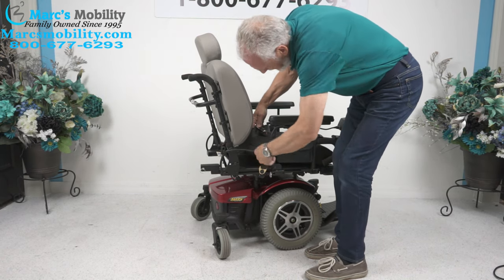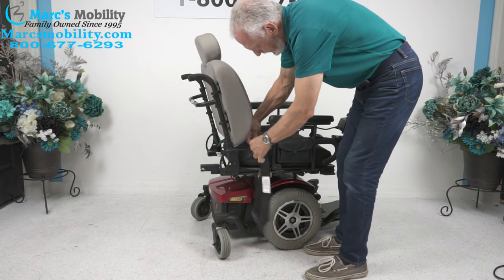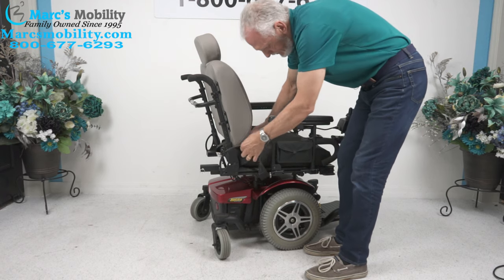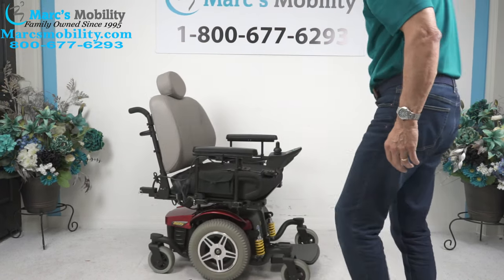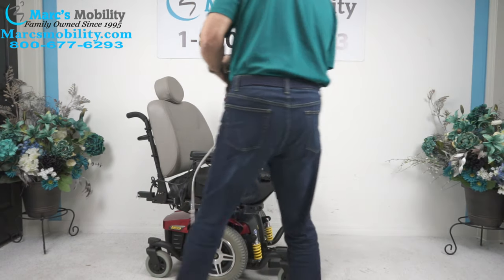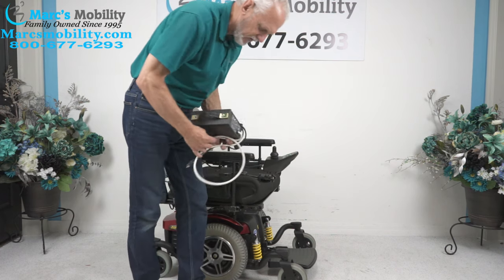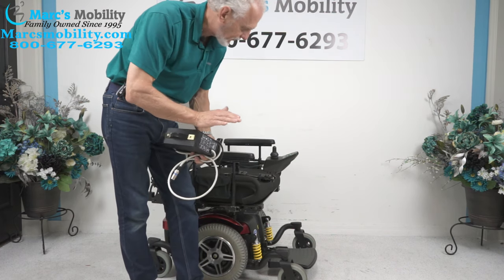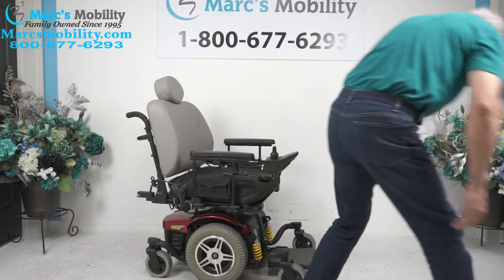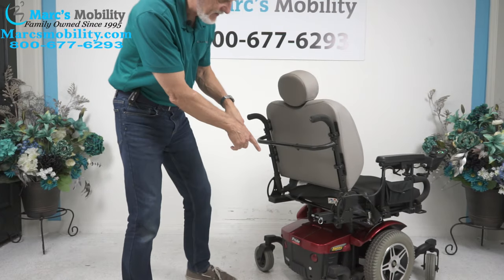You also have a safety belt. When you charge this chair, you take your charger and plug it right below the joystick. As soon as the light turns green on the charger, the batteries are full — so you don't have to worry about overcharging your chair. By the way, there are two batteries in this chair.